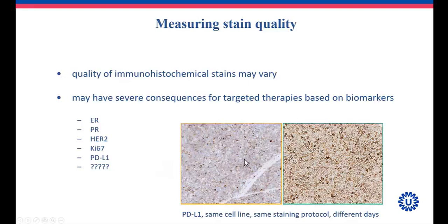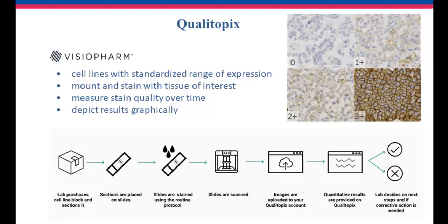This is PD-L1. On the left and right, you see the same cell line, stained with the same stainer, with the same antibody in the same lab. And it's quite visible that there are big variations in the PD-L1 intensity, and that's again not acceptable. And this is not unique. All of us experience some stains that have to be redone because we can visually detect that there is a problem.